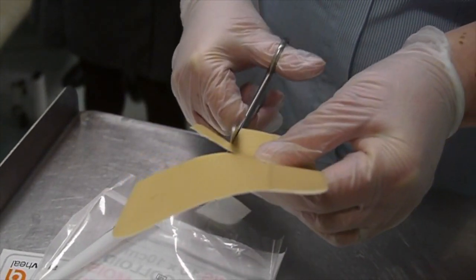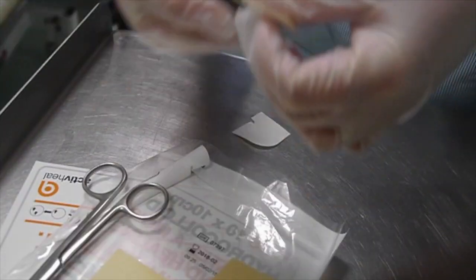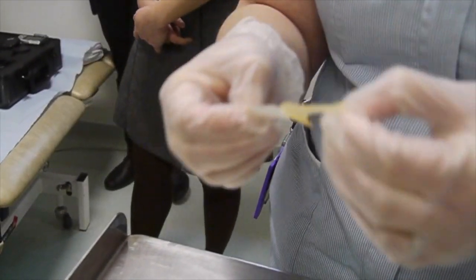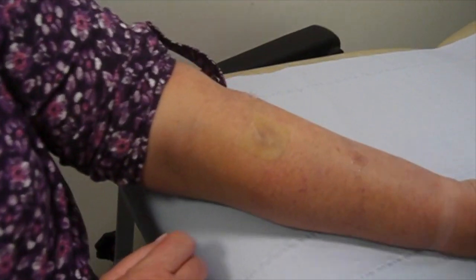A second piece is being cut to cover another piece of ointment and eczema. Again the backing paper is peeled off and now the nurse is going to apply it over another patch of eczema.